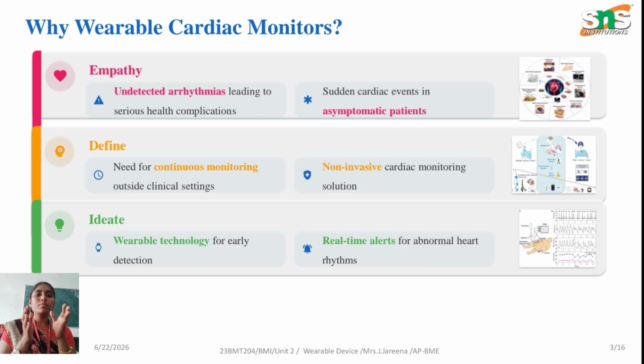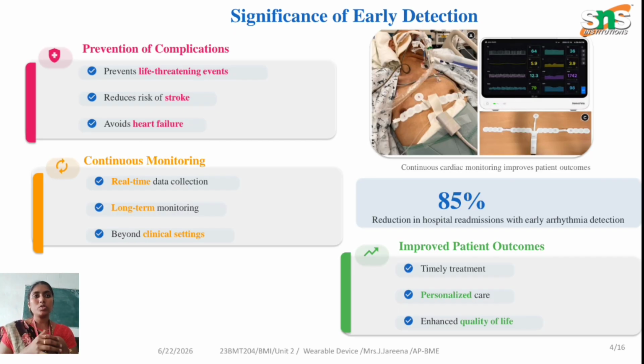Because of that problem statement, we have brought up the solution: we need a device for continuous monitoring, and it should be non-invasive, and even the clinicians or physicians have to operate the device on the other end to see the status of the patient's body. This is the reason wearable cardiac monitors have come into the market.